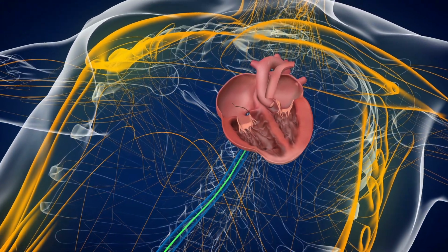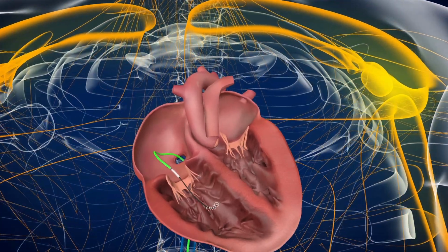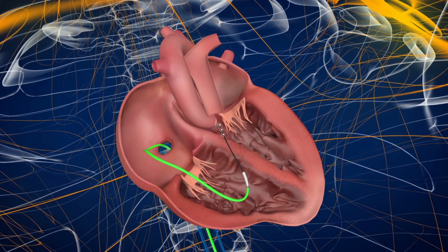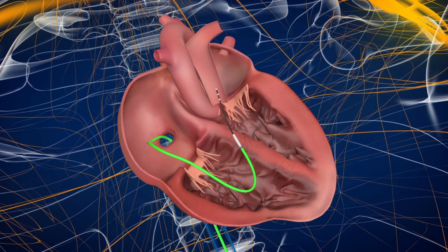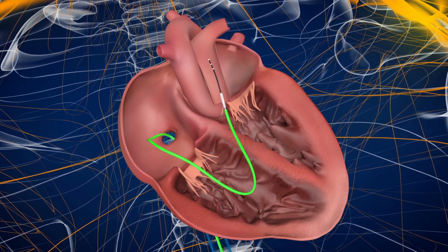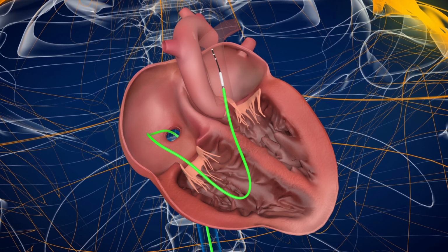Visible but safe wire using passive MRI markers. The 3 markers on the tip of the guide wire are used to navigate the wire to and in the heart, along with a pressure catheter to the right ventricle and into the pulmonary artery. Then the balloon of the catheter is inflated to position the catheter firmly at the desired location.